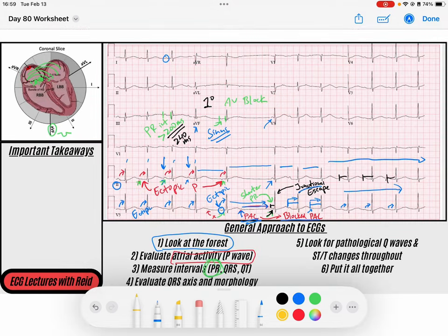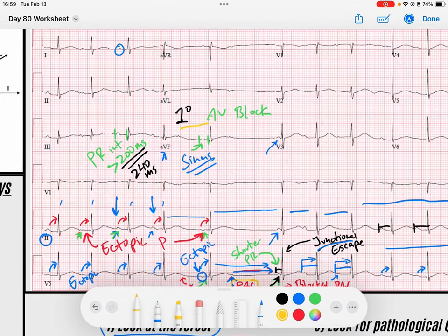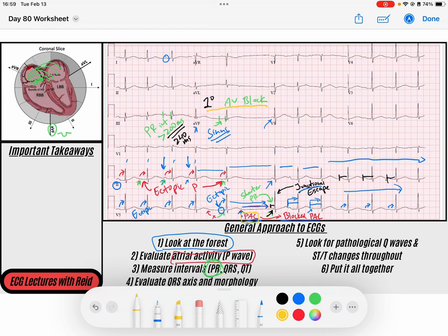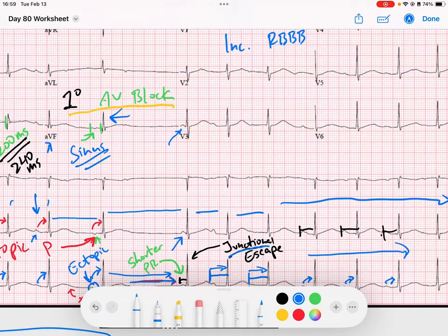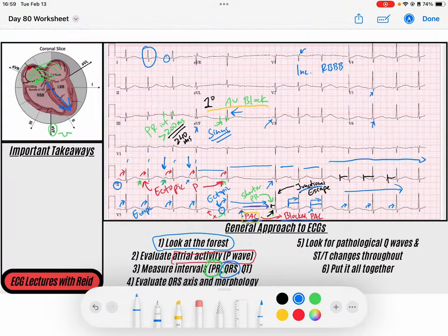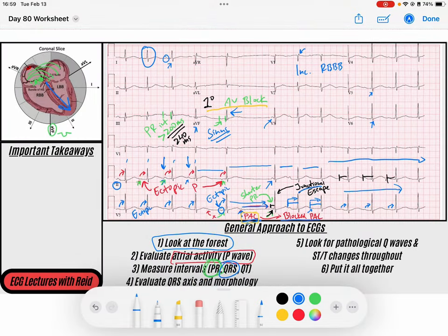This person has a first degree AV block with some PR intervals changing because of decremental conduction. Evaluating our QRS complex: it's upright in lead one and AVF, so the QRS axis is down to the left — normal. There's a little bit of what we'd call an R-prime in V1, but it's still narrow, suggesting an incomplete right bundle branch block. We can also see some slurring of the lateral S waves, which hints at an incomplete right bundle branch block — meaning slightly delayed conduction through the right ventricle.